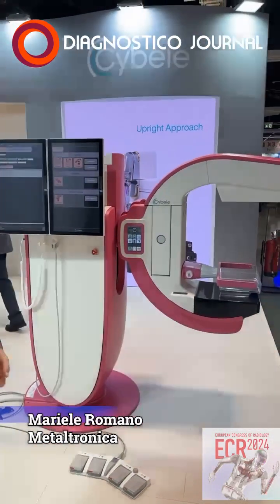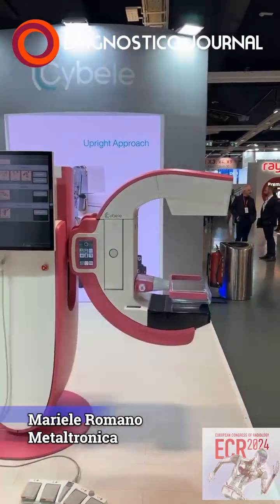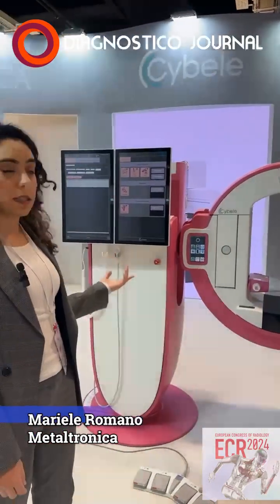I'm Mariele Romano from the R&D department. I'm a medical physicist, and today I will introduce you to this new unit that we are presenting at the ECR 2024. This is the first unit that is multimodal.